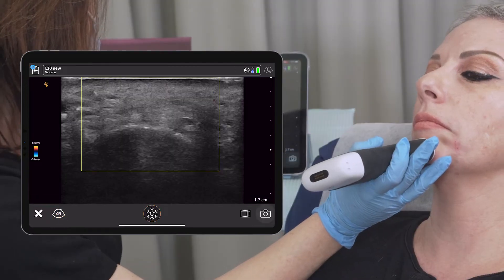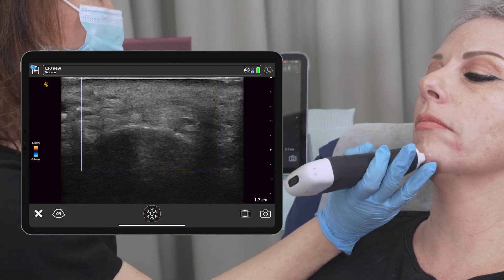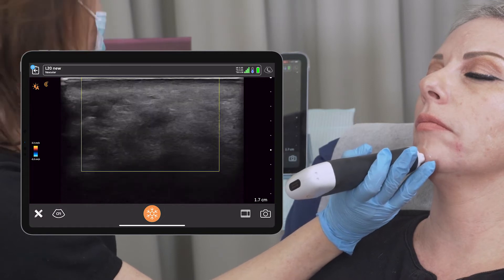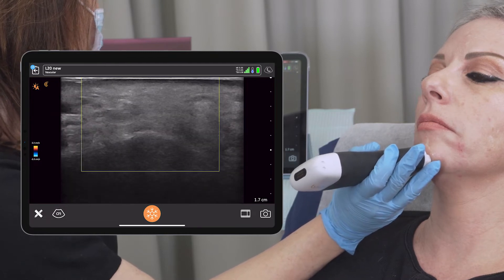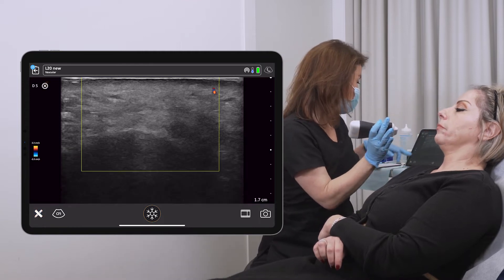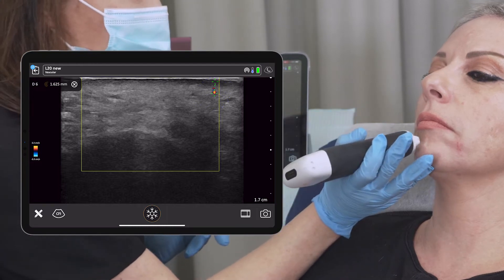As you know, there is quite a big variability in all the areas and it's not always easy to locate the vessels, but the vessels in this case are there. I will measure the depth of the vessel — it is 1.6 millimeters in depth.